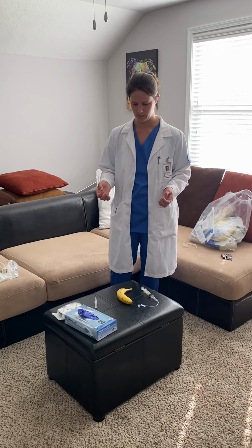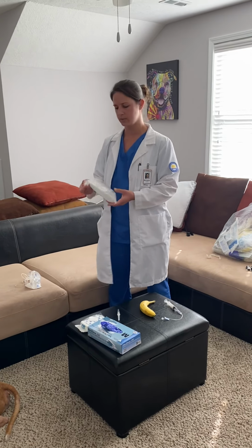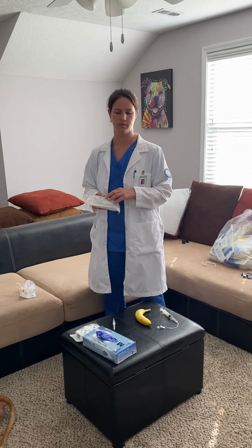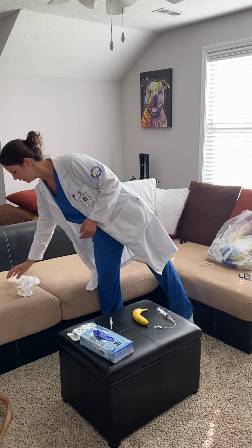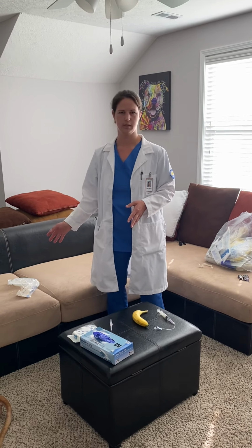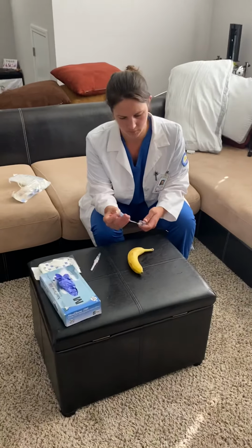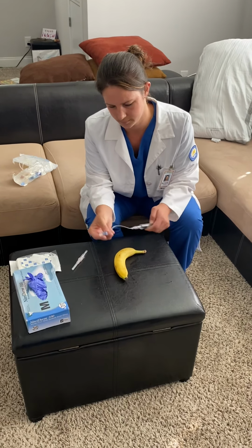And I also, since we're administering 0.9% normal saline after we do the IV push, have cross-referenced for compatibilities for the fluids and the medication that we're pushing today. I've already primed and prepped my IV fluids. Make sure there's no air bubbles in there, making sure it's a sterile technique, and that it's hung and ready to go. I have my normal saline here that I have gotten all the air bubbles out, primed and prepped here.